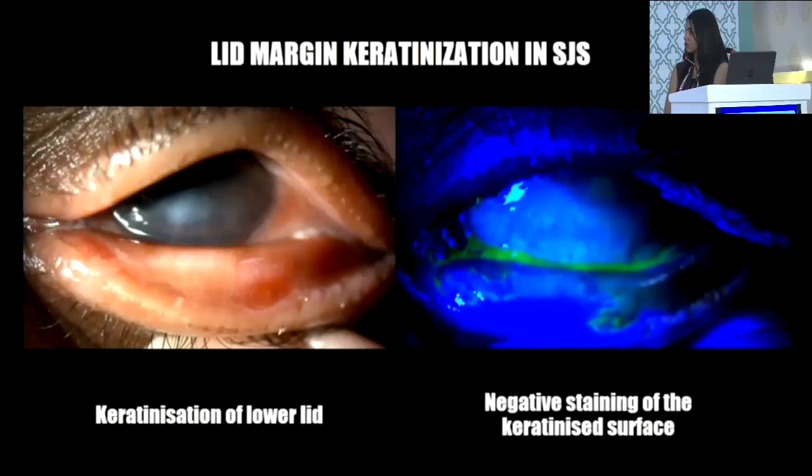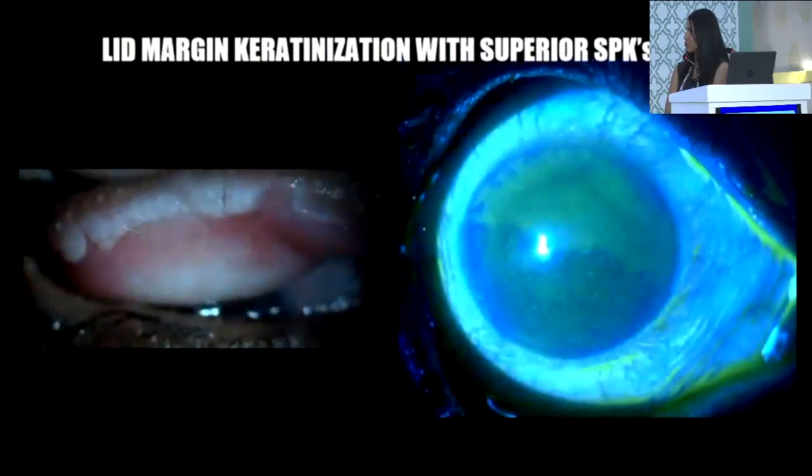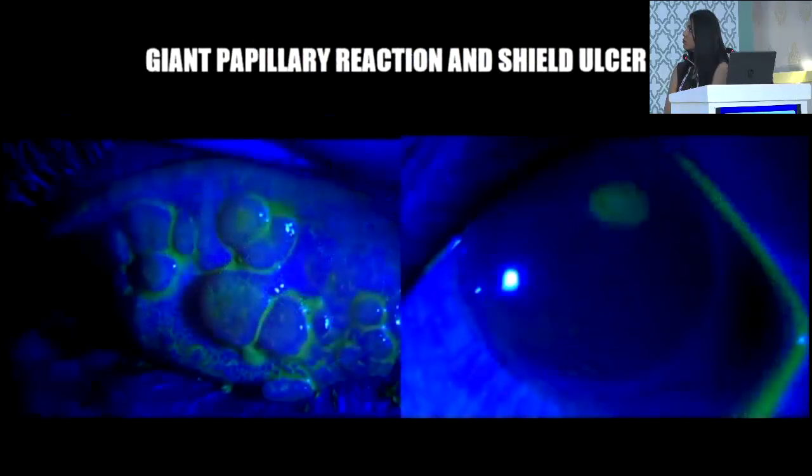In Stevens-Johnson syndrome, the keratinized surface of the lower lid margin appears elevated, causing negative fluorescein staining. The lid margin keratinization can also lead to mechanical trauma of the cornea. In VKC, giant papillae form on the upper lid. Staining of the central core indicates an active papilla.